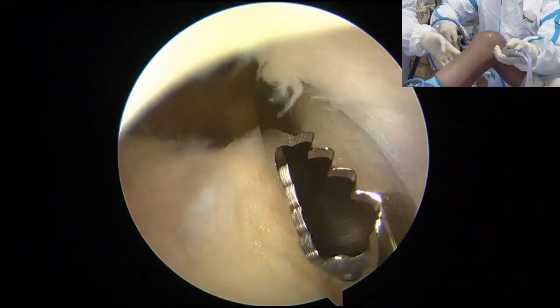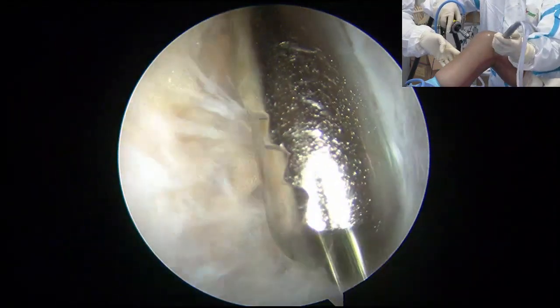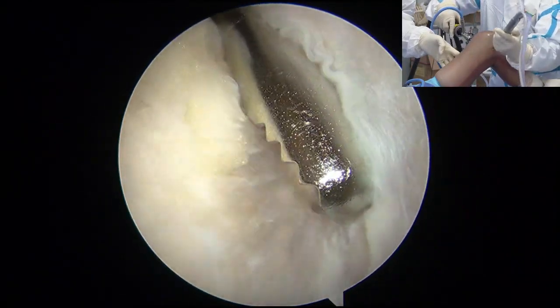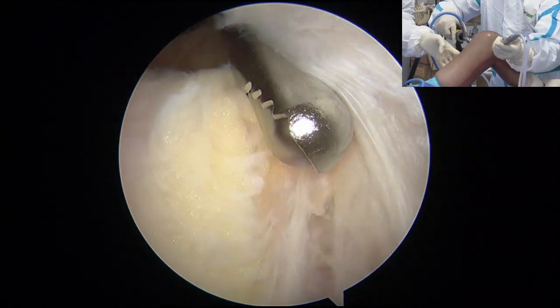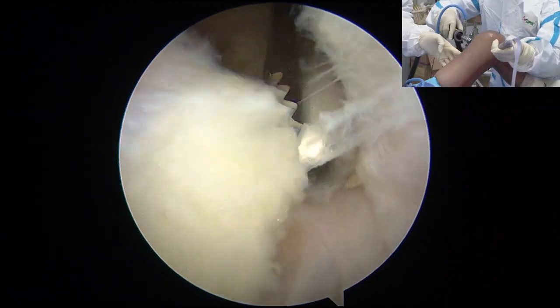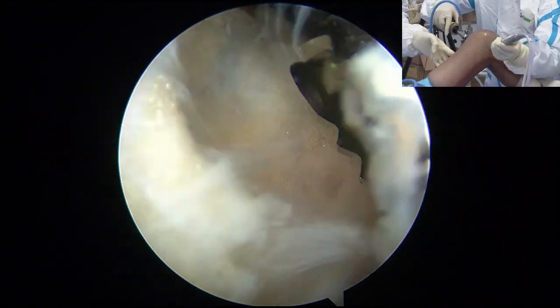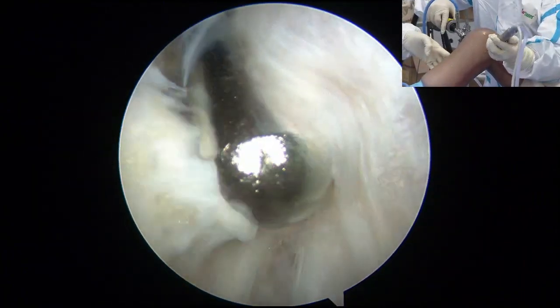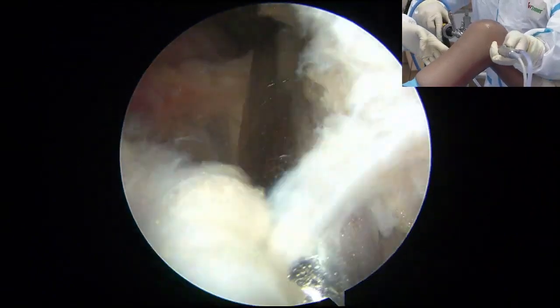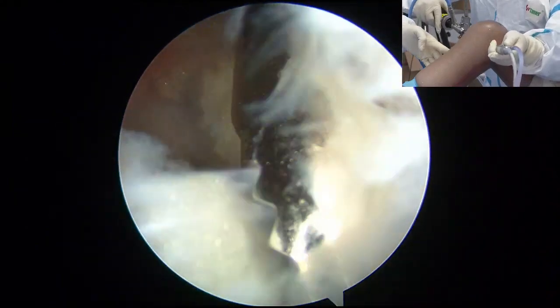那后方这个间室呢，如果是单纯做 PCL 重建的话，不再继续往下松解呢，也够用了。但是如果做腘肌重建的话呢，还要继续往下去松解。Okay, good. Slowly get down that way. 慢慢的往下松。So I just show you, and then I will go back to the ACL. This is the process of the portal placement. 那这一步呢，我只是为了演示方便。接下来我是会做 ACL 的操作。Okay, good. That way. First, just for PCL, that's enough.